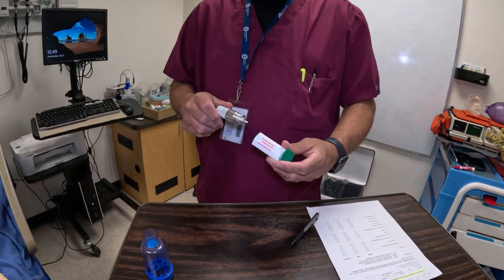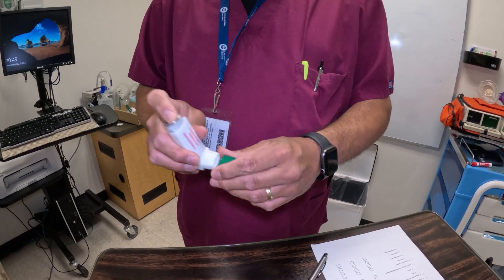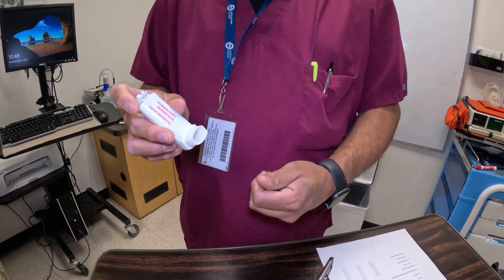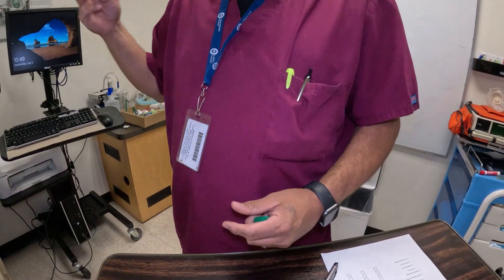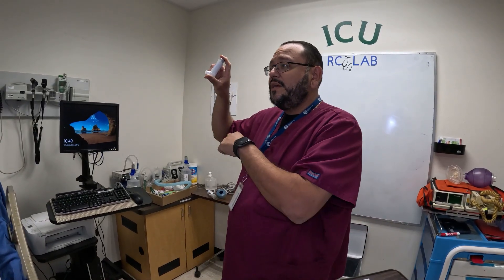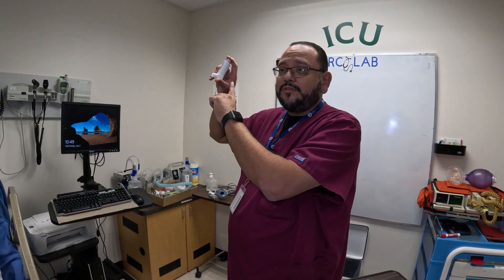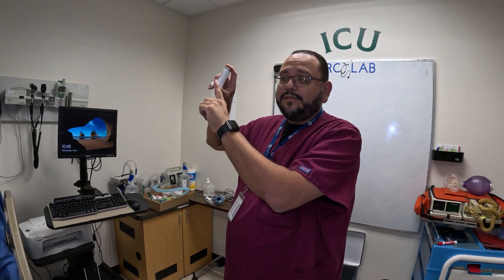This is for demonstration purposes. This is the actual medication that goes inside the boot, and this is the mouthpiece. When we take this out, we want to shake it a little bit. You want to waste one — push down so you can see the medication. If you don't see it the first time, do it a second time, because you don't want to give the patient more propellant than medication. That's why we waste.